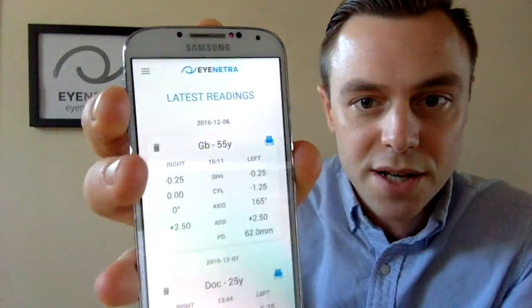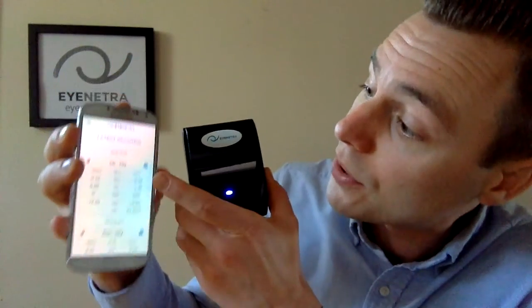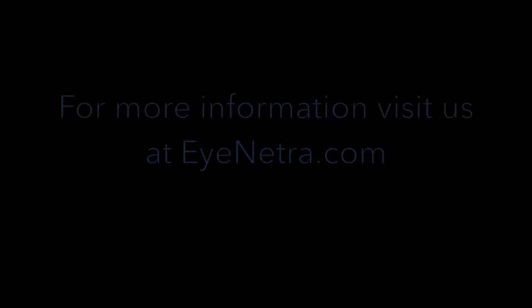You can quickly and easily print the results of the EyeNetra autorefractor and Netrometer by simply using the EyeNetra Bluetooth printer. To print a result, first power on the printer by pressing and holding the power button — the blue light will illuminate as soon as the printer is turned on. Then access the readings on the phone for either the Netra or Netrometer, select the drop-down menu, select Readings, and you'll see a blue printer icon appear. Simply tap the blue icon to print a result. Easy as that.